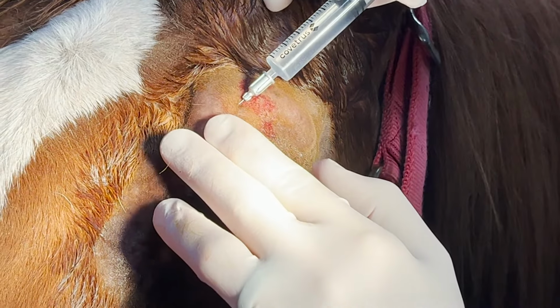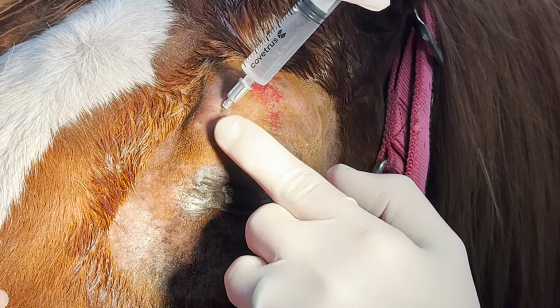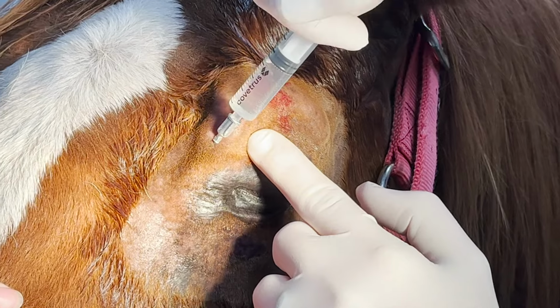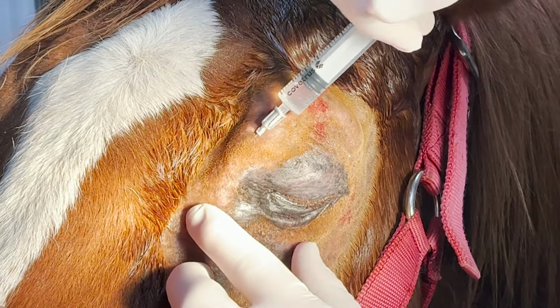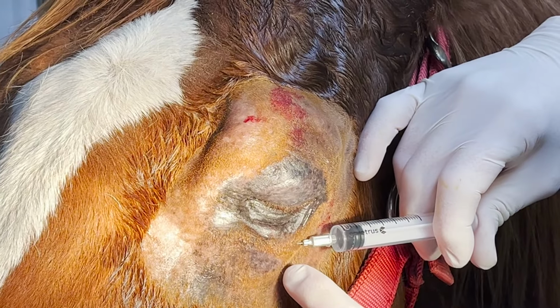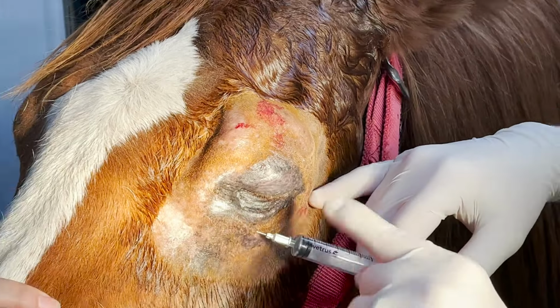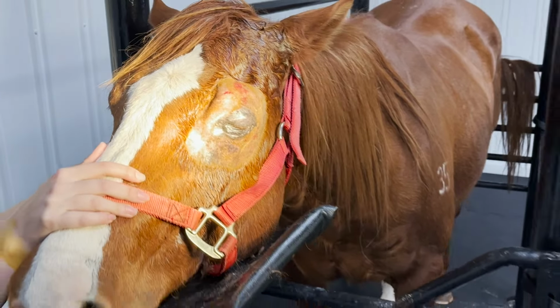There's a couple different techniques we can use. In this one, I'm going to use a bit of a modified technique where we take a spinal needle and go behind the eye and block it. The other way you can do it is up in that depression behind that syringe. You can go straight down and hit it. But the way we're going to do it today in this video seems to work better, because you definitely want that thing numb when you go to cut it.